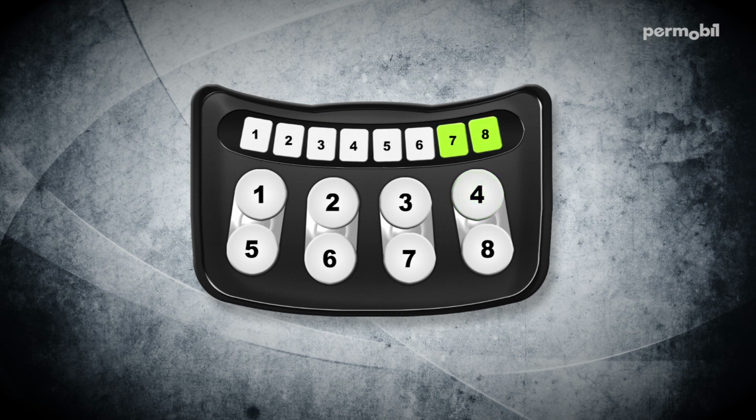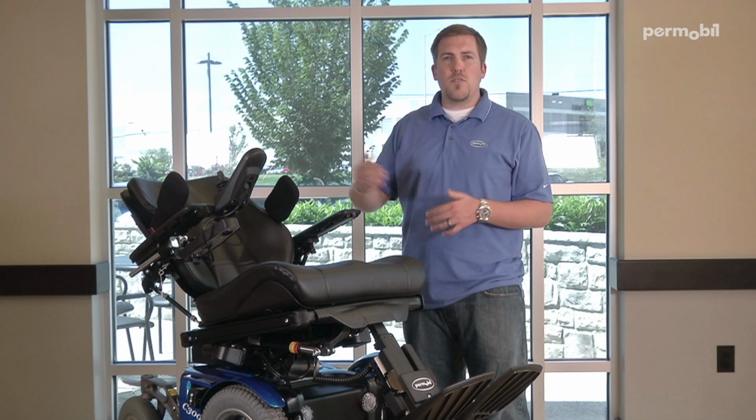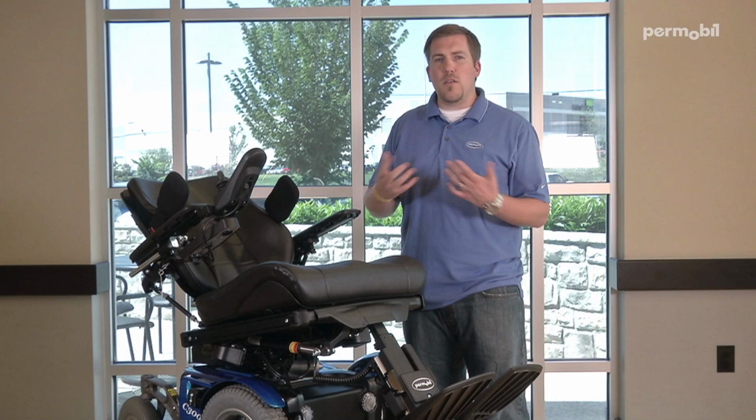If I want to save this again in position number 1, I'm going to press and hold button number 5 on my switchbox. When I do that, I'm going to wait for the LED above that button to turn green, and I'm going to hear a short audible tone as you did a moment ago. Once you get the green LED and the short tone, you know that you've properly saved this position into that storage mode. Go ahead and repeat this process for the other 2 storage memory spots, and then you're all set to go.